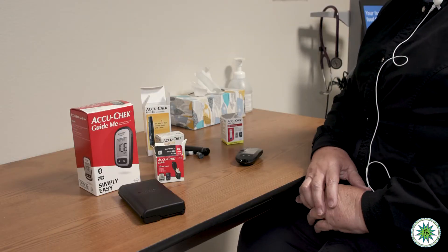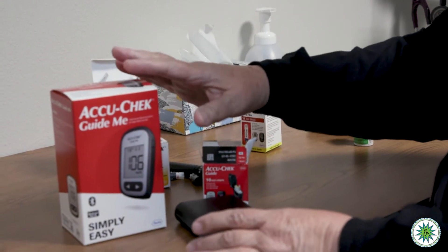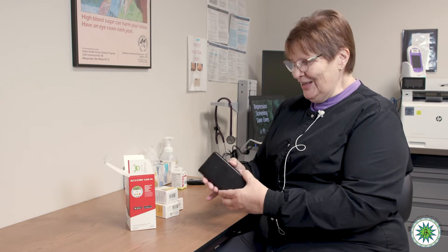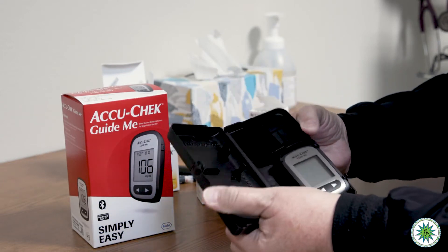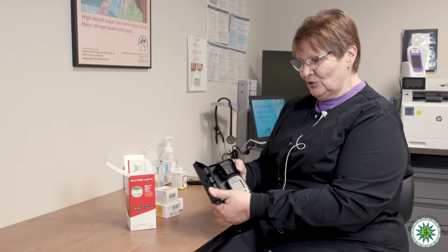Now I want to show you what we have that's new. It's also by AccuCheck, but it's called Guide Me. It's a new meter — a little bit smaller in a smaller case. The first thing I didn't do correctly was just open this case. All the ways you might think you open it, you actually just push against this little spot here and it pops open. It took me a couple of tries to figure that out. It snaps back shut, and then you push on the side to open the case.